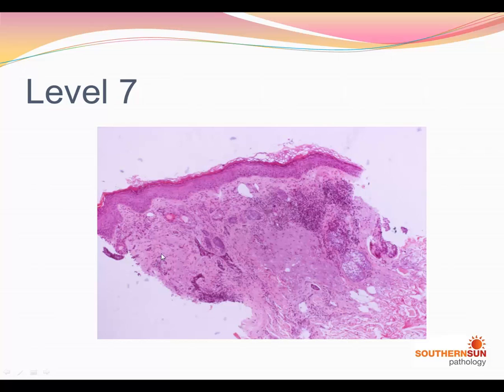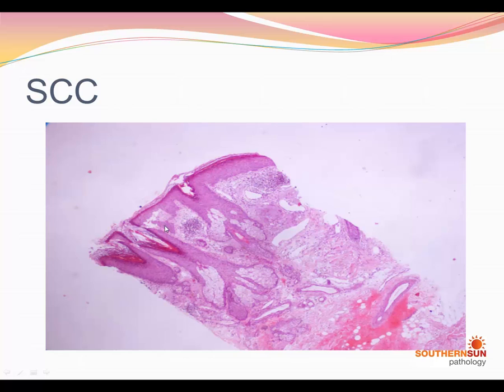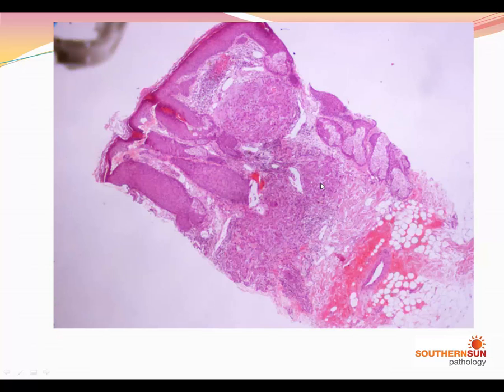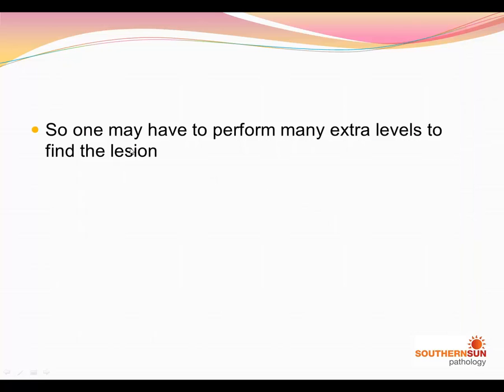A similar case was a patient with a report of squamous cell carcinoma. Again, in the initial levels there was nothing much to see — there's a little nodule here, but this was actually not squamous cell carcinoma. In the initial levels there was absolutely no squamous cell carcinoma, only solar damage with an inflammatory infiltrate. But only in the very deepest levels did we find squamous cell carcinoma — all this squamous epithelium extending to at least two or three millimeters deep within the dermis. So one may have to perform many extra levels to find the lesions.